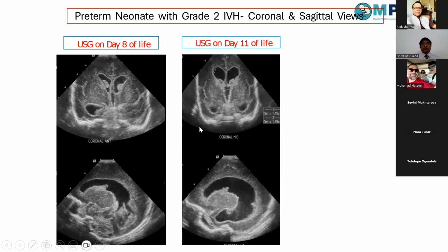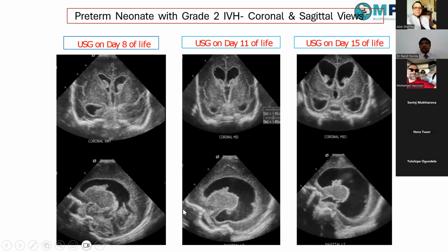Again, more and more ballooning dilatation that you are seeing, rounding off, and the occipital horn getting bigger and bigger. So you can see the progression by looking at the picture. Yes, it is obvious for us there is ventriculomegaly, but having an objective measurement of all the indices that we talked about will help us to see when to intervene, how frequently to scan, do we need to do a lumbar puncture, do we need to go for surgical intervention? These things will guide us in terms of the measurements.